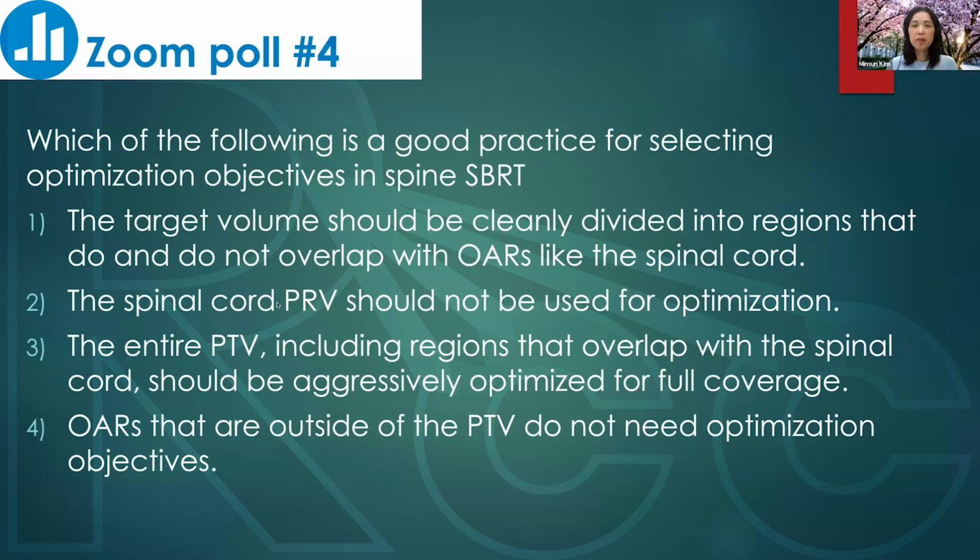So Dustin, a couple of questions from the audience. What is the normalization applied in spine SBRT? Prescription normalization? Good question. You can't very often achieve V100 equals 95%, because you're almost always going to undercover to protect the spinal cord. That means that often your dosimetrist will be setting coverage to something like 92% or 88%.